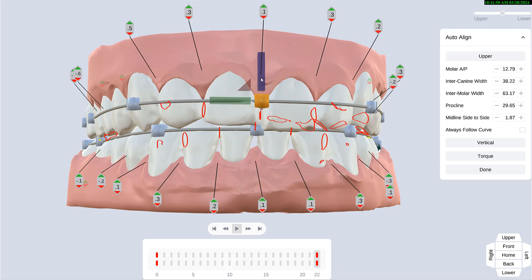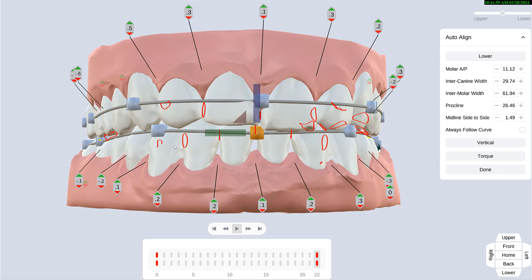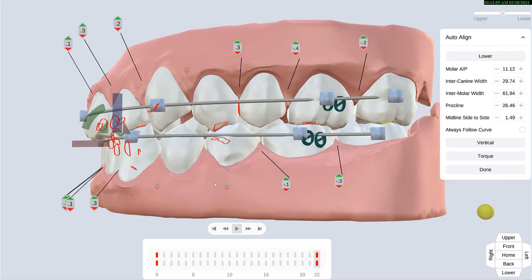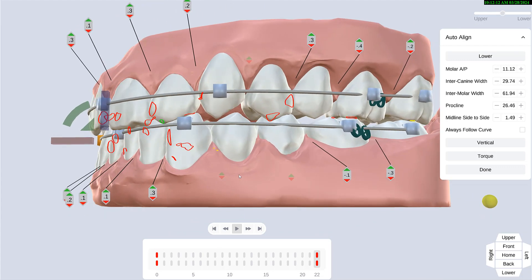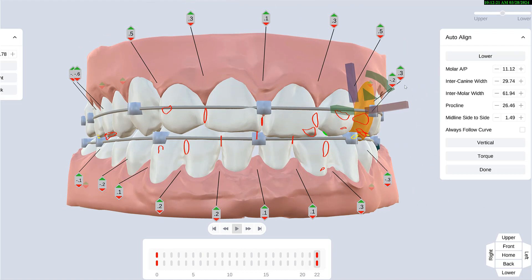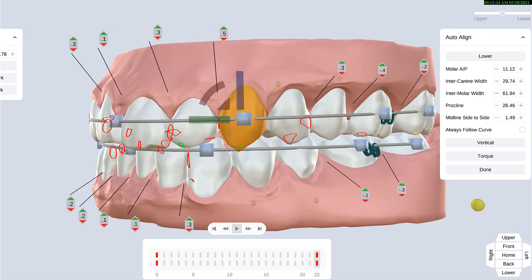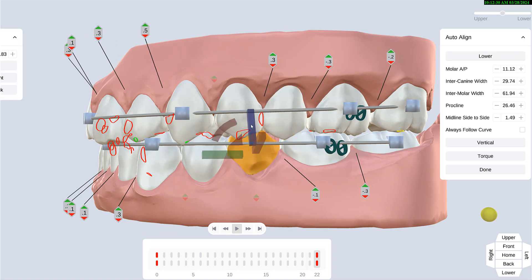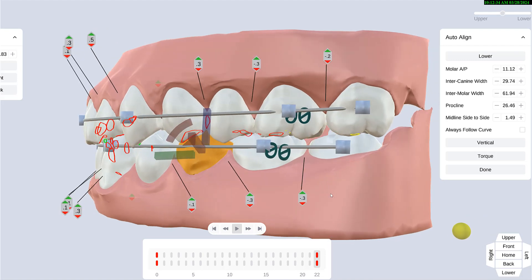If you don't like what the computer has done, you can add a little bit of extrusion here, or maybe intrude the lowers a little more. If you believe in the straight wire, you have to get it into its correct position. You can also look at the alignment and say 'I don't agree with it because this tooth is non-inclusion,' so you can select the tooth and correct a single tooth. It saves a lot of time — you can see when this tooth is down a little bit and this one up a little bit, so it's a very good first step in alignment.